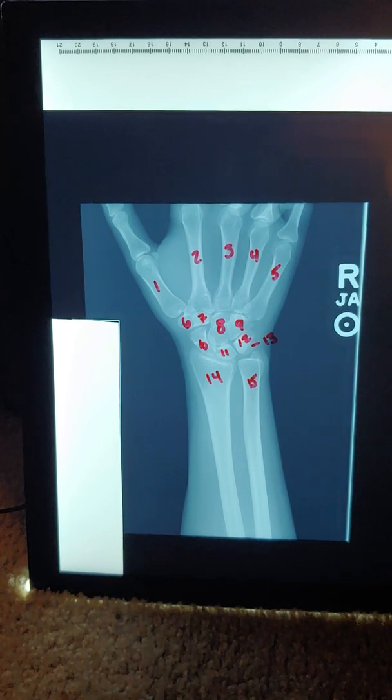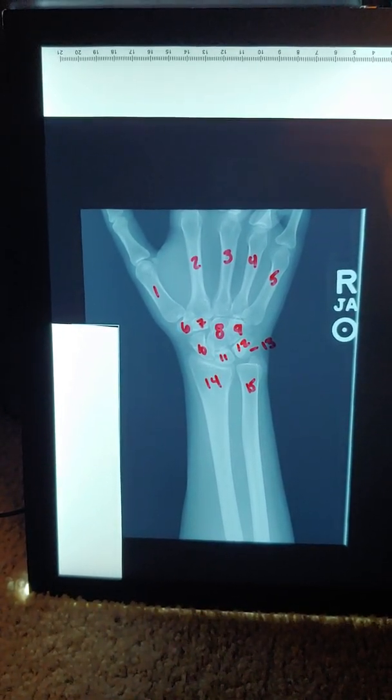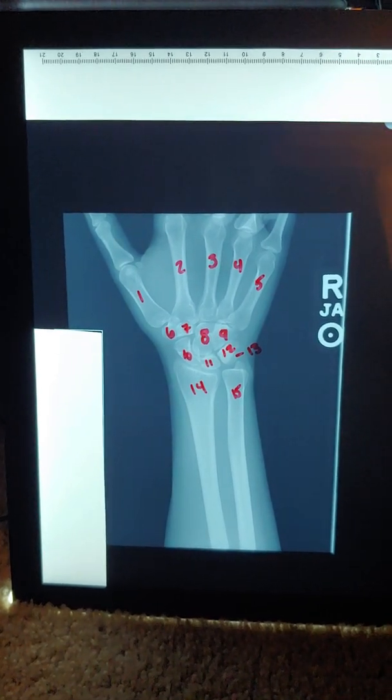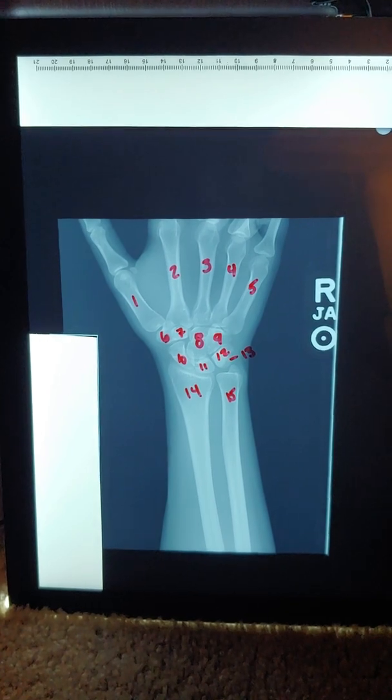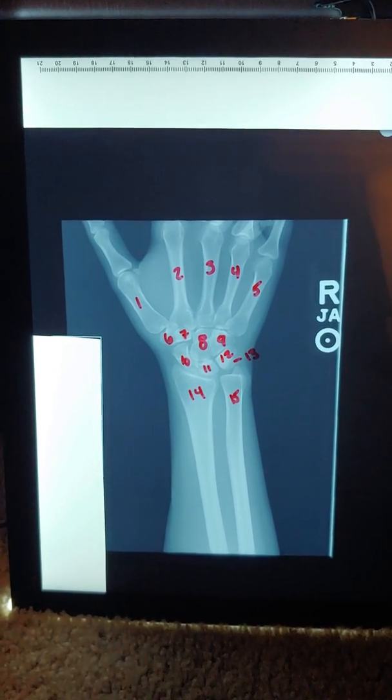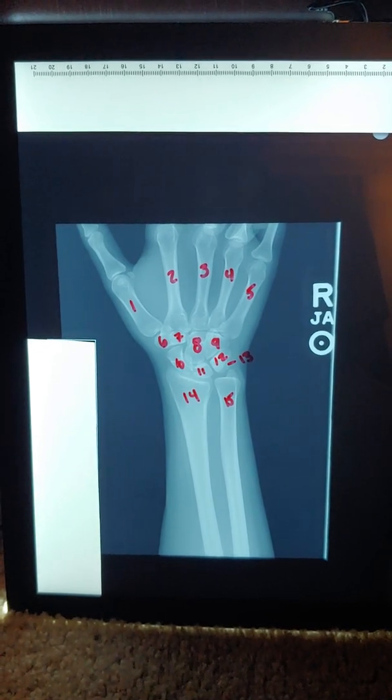The exam was done on a digital Carestream cassette, 14x17, tabletop with no grid. The PA was done at 60 kVp at 2.5 mAs, and the lateral was 60 kVp at 4 mAs. And the SID was 40 inches.